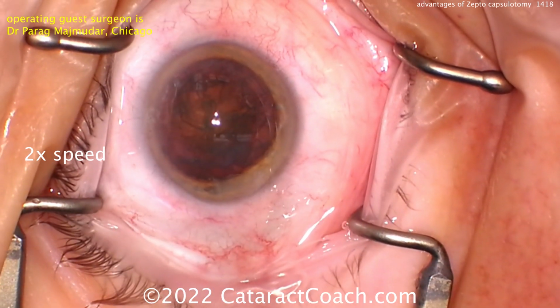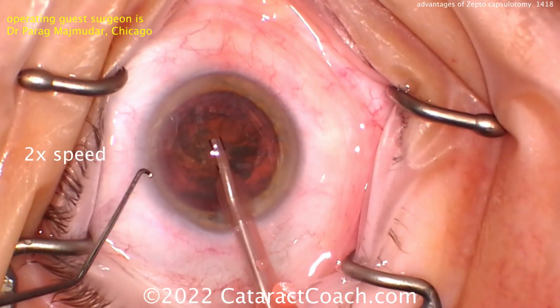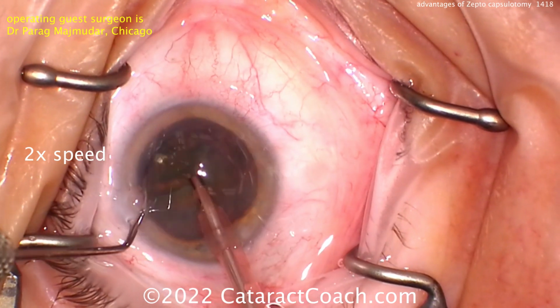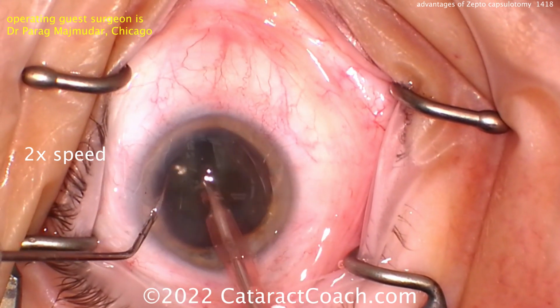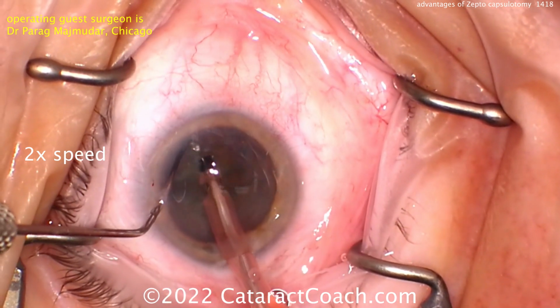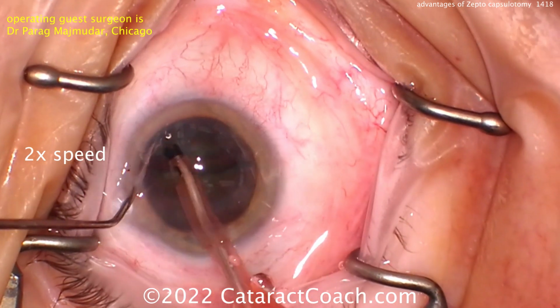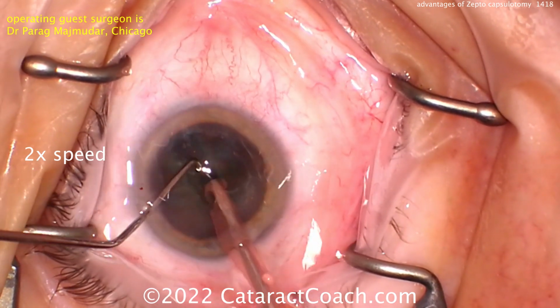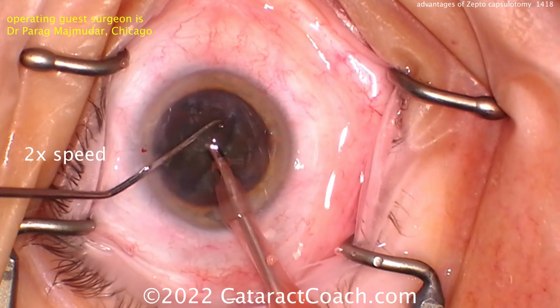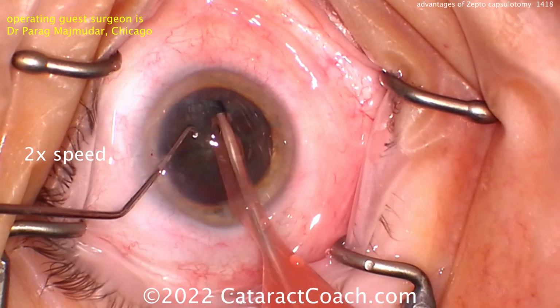Now, you can also use this in a smaller pupil case. Let's say you had a case where the dilation was only 4 millimeters. Well, you can still put this device under the iris and put it right on the anterior lens capsule and still create your 5 millimeter capsulorhexis, even in a case where the pupil is 3 or 4 millimeters. So that's a big advantage over, let's say, a femtosecond laser, because femtosecond laser requires that dilation in order to pass the laser light energy through the tissue. And if it doesn't dilate, you can't do it. So in this case, you can place this in the eye, even with a small pupil.